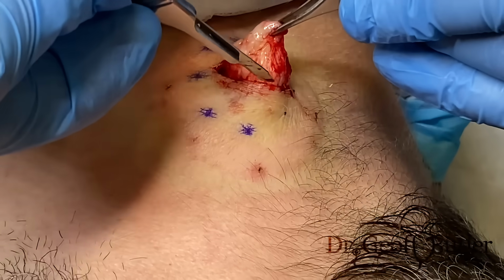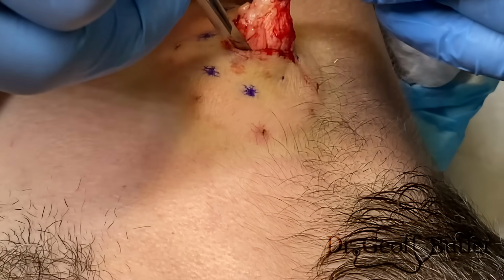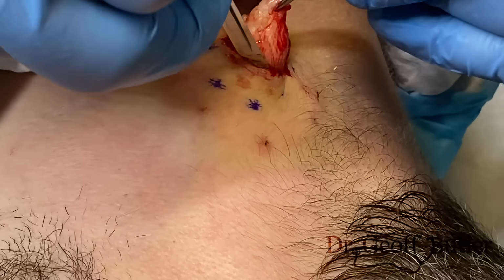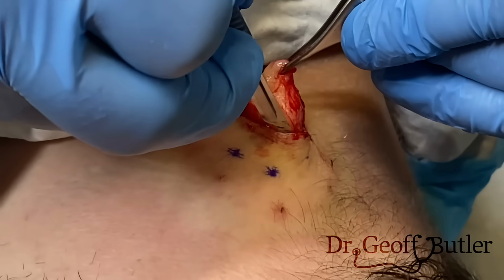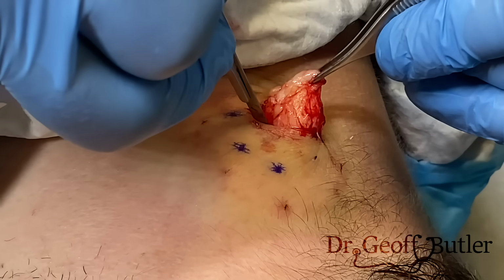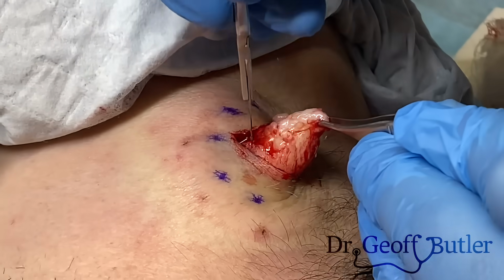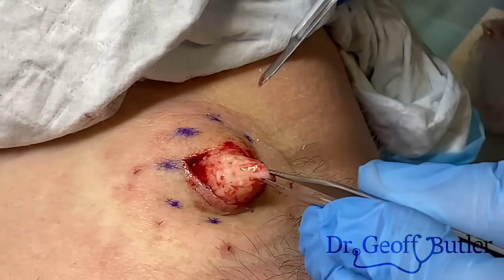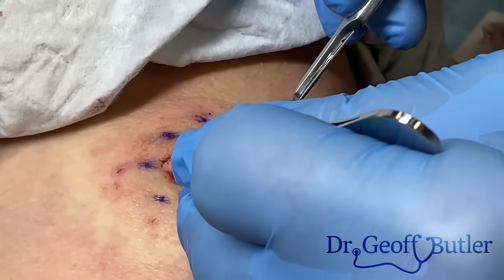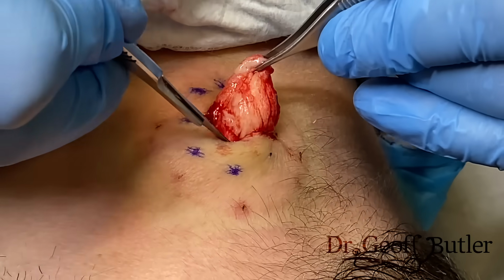So you can see here, there's a little bit more swelling there, so I just want to make sure that part, we're a little bit careful with it. Not from the standpoint of underlying structural issues. I just don't want to rupture the membrane if I can avoid it. So this is actually behind it. This is where I just want to make sure I'm visualizing my structures.